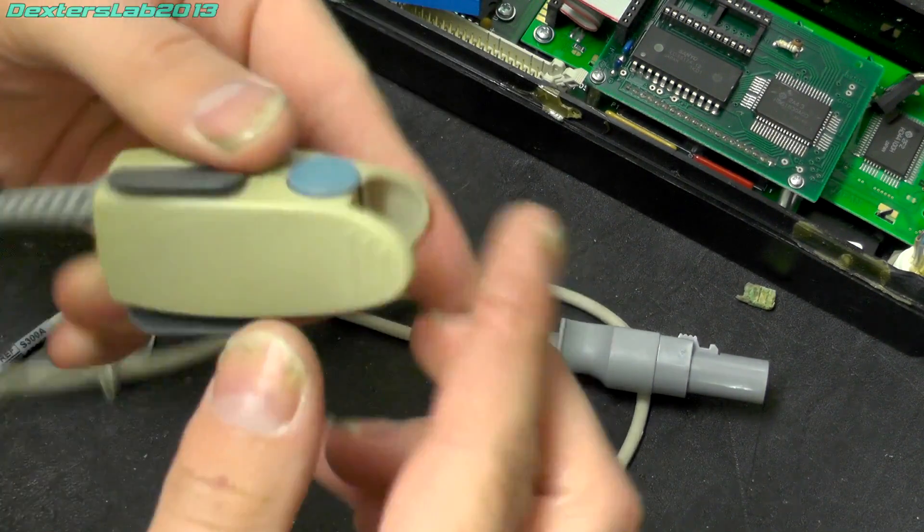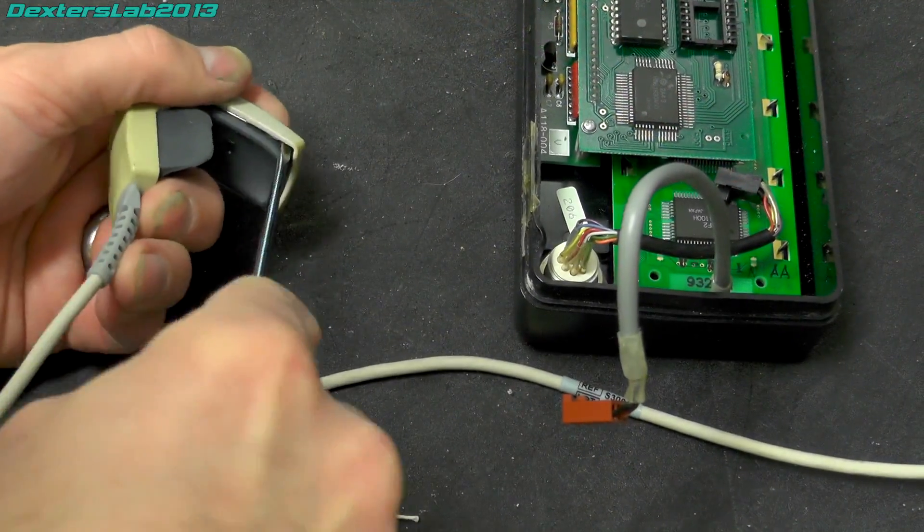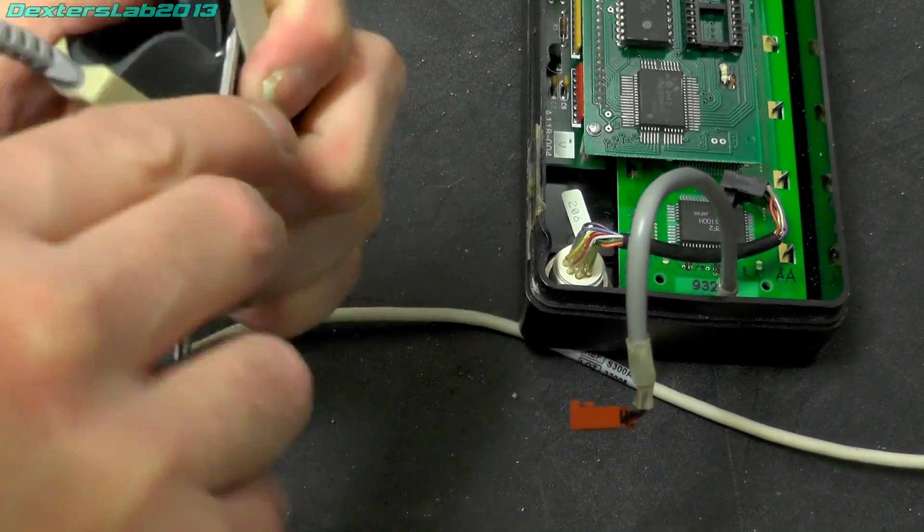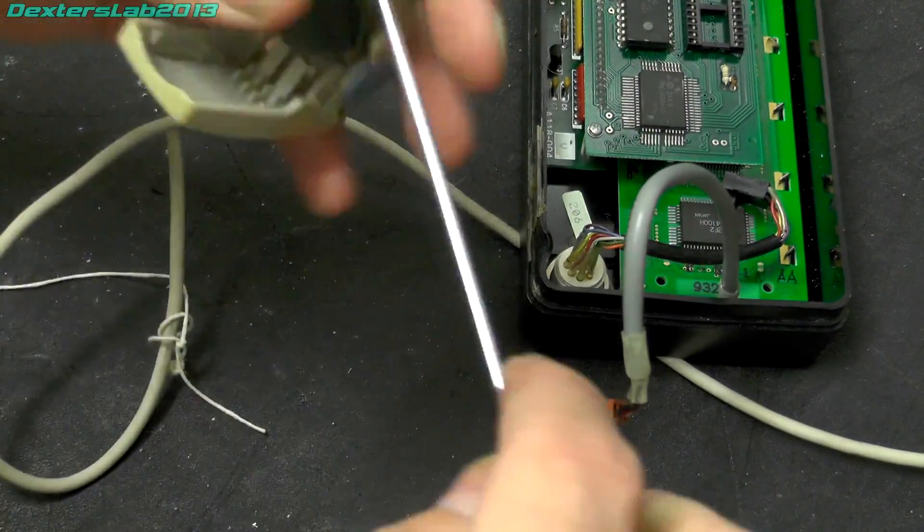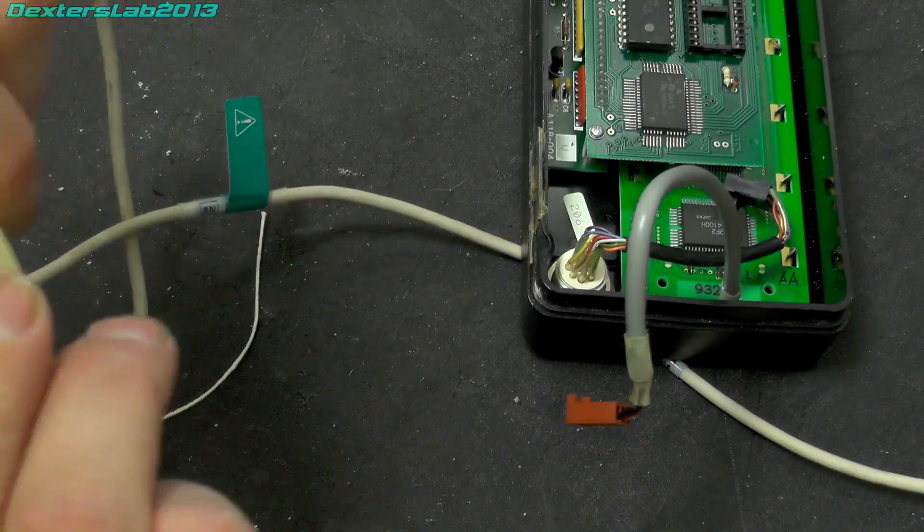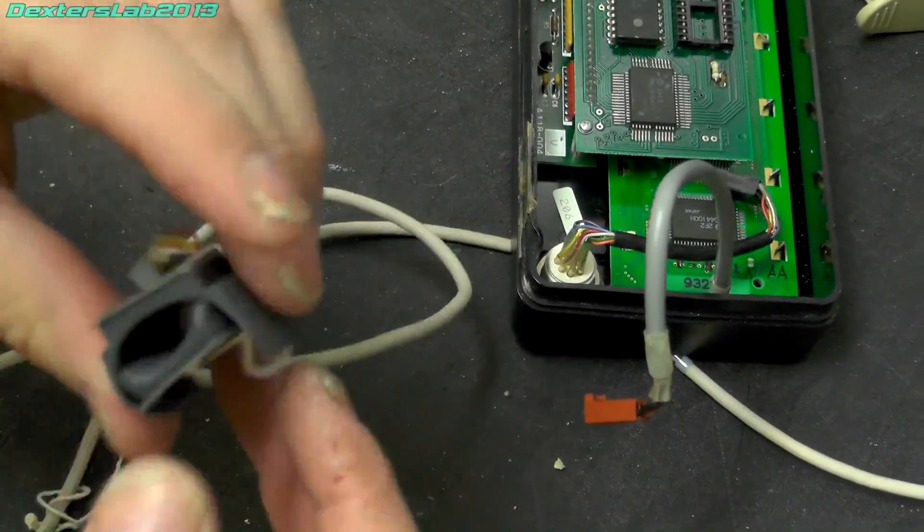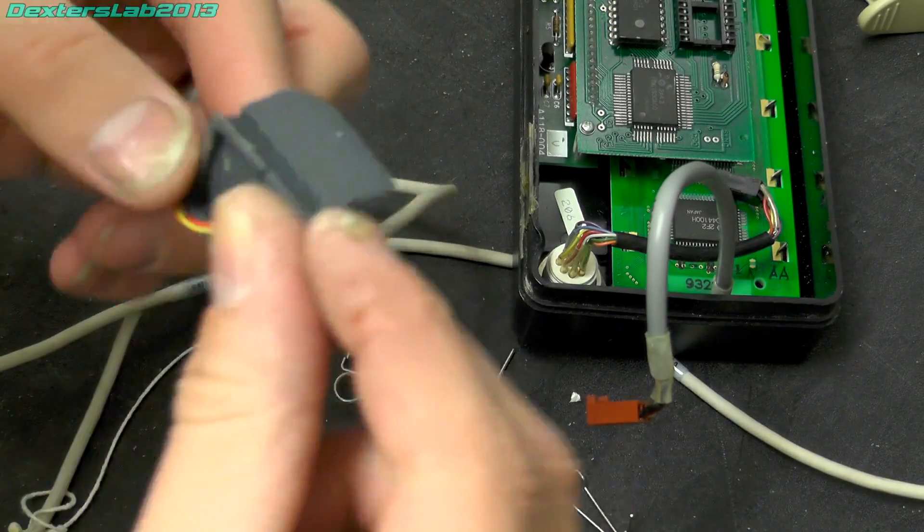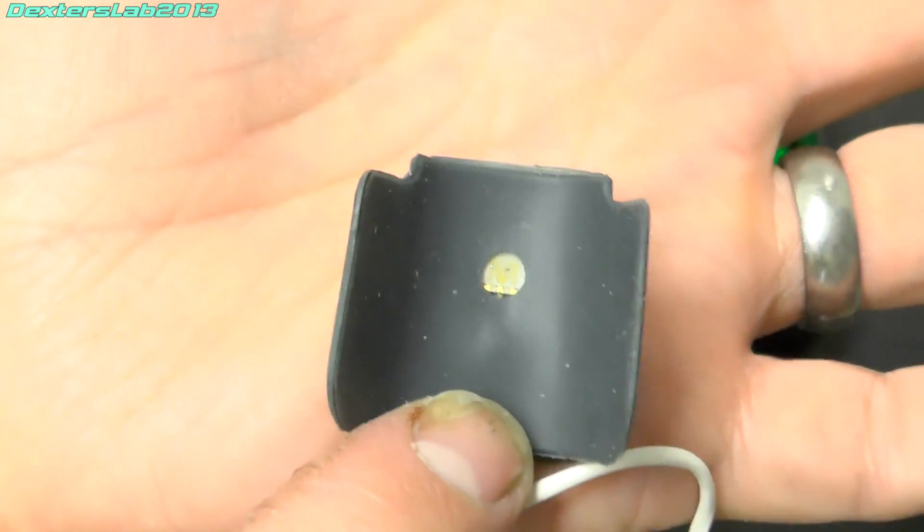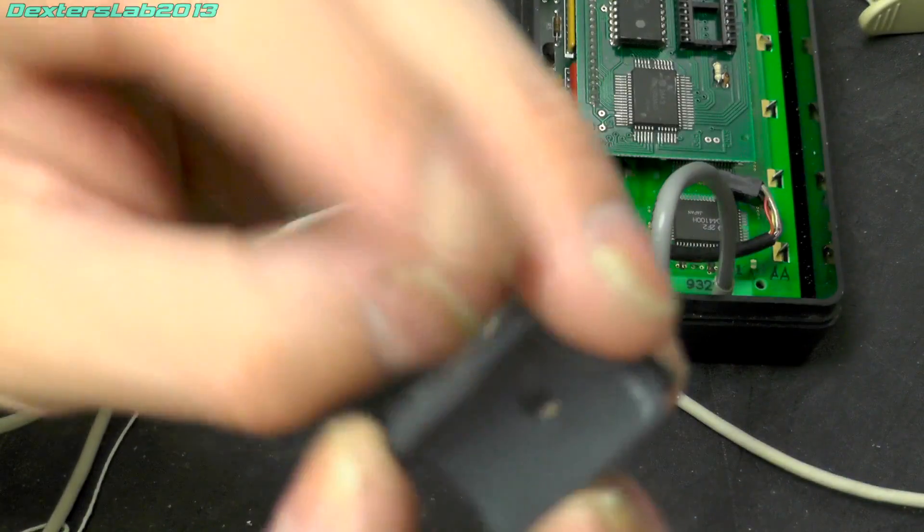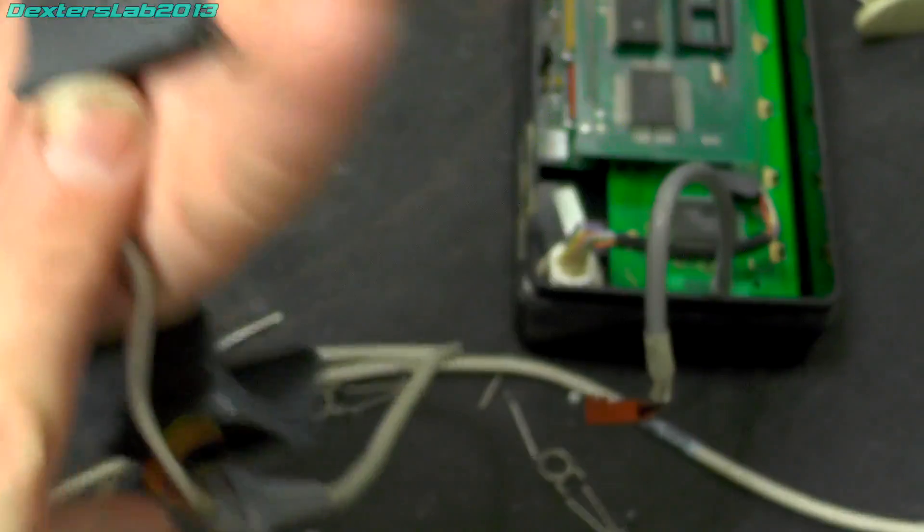Now let's see if we can just pop this apart a little bit. So that looks like it is the two LEDs providing the light sources.